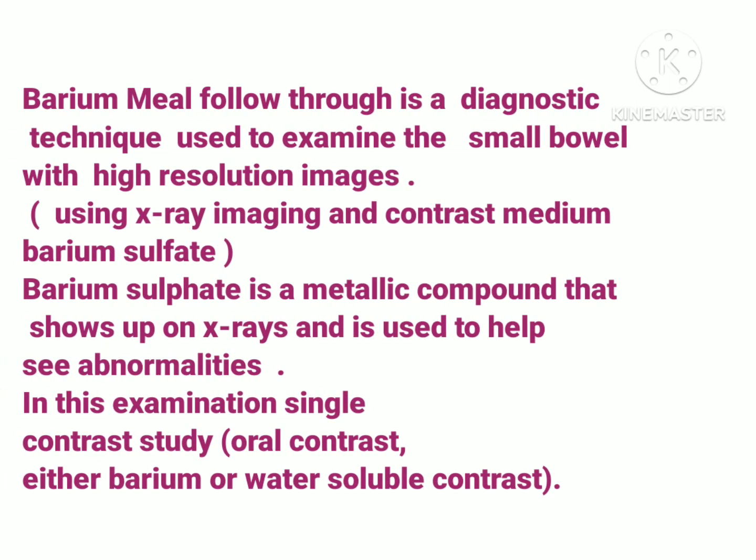Now when we talk about barium meal follow through, it's actually a technique that's particularly designed to obtain high resolution images of the small bowel with the help of X-rays and contrast media barium sulfate, which is given orally to the patient. Now, in barium meal, we have studied that we visualize stomach and small bowel, but only one part of the small bowel, that was duodenum.